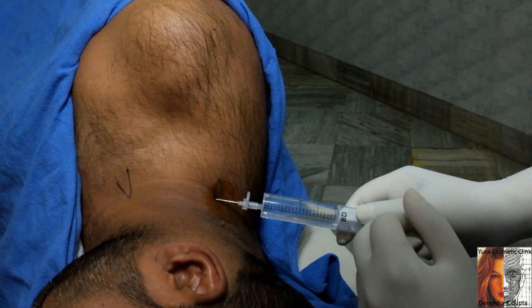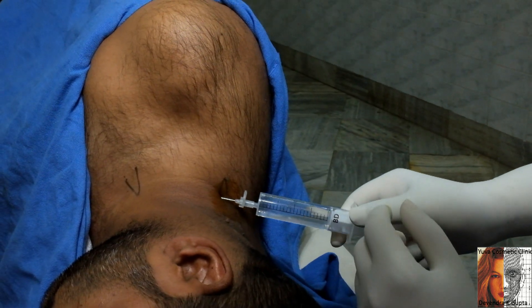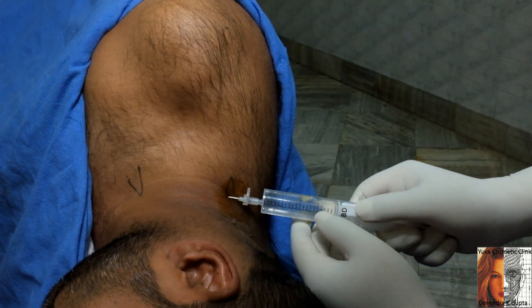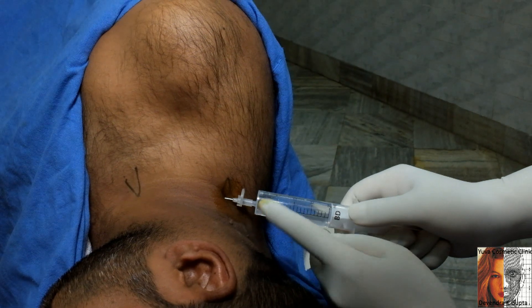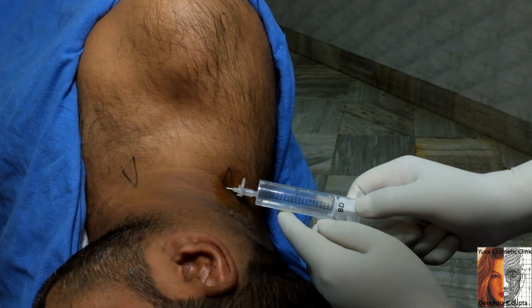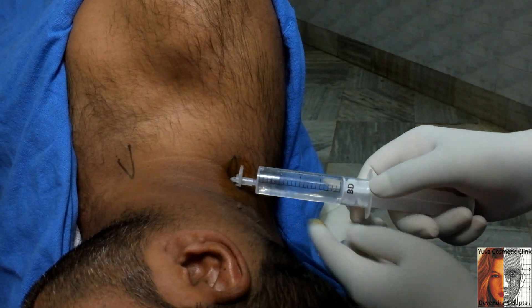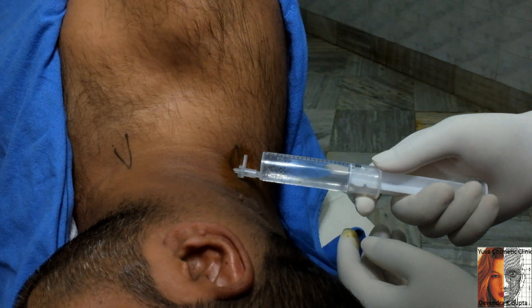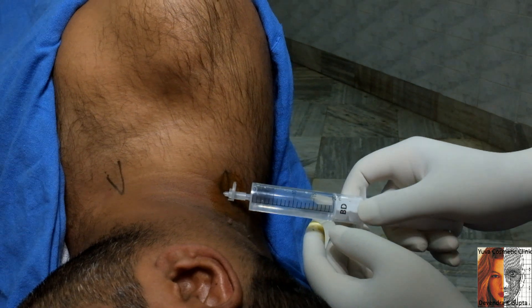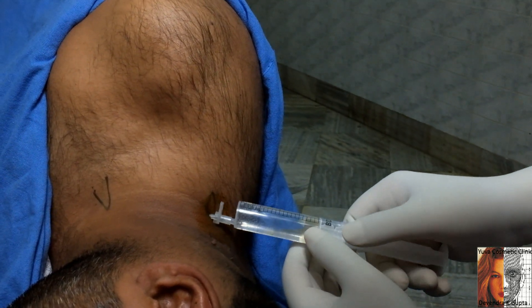I am going just deep to the muscles here — deep to the levator and deep to the posterior scalene. Slowly move; there is no blood. Always keep watch that there should not be any blood. Now rotate the syringe — aspirate, inject, aspirate, inject. There should not be any resistance here.